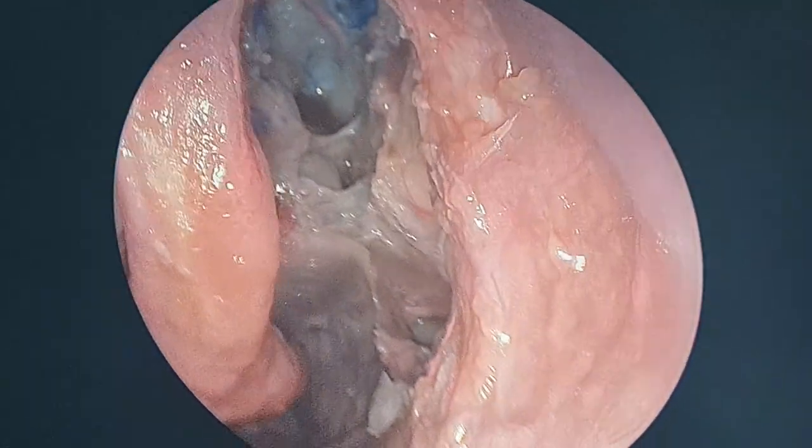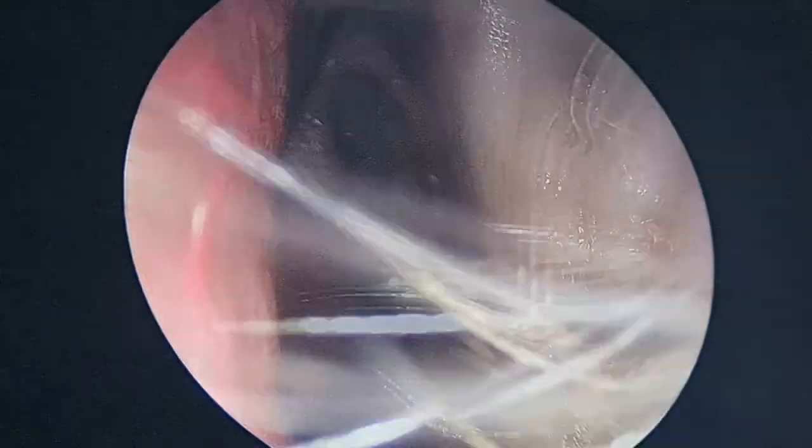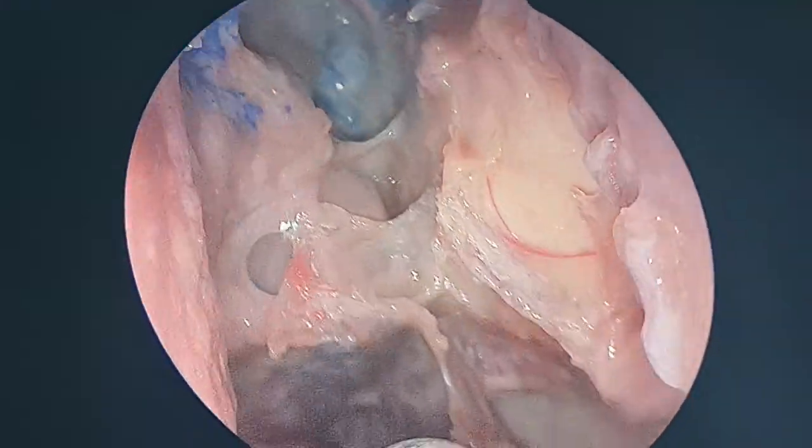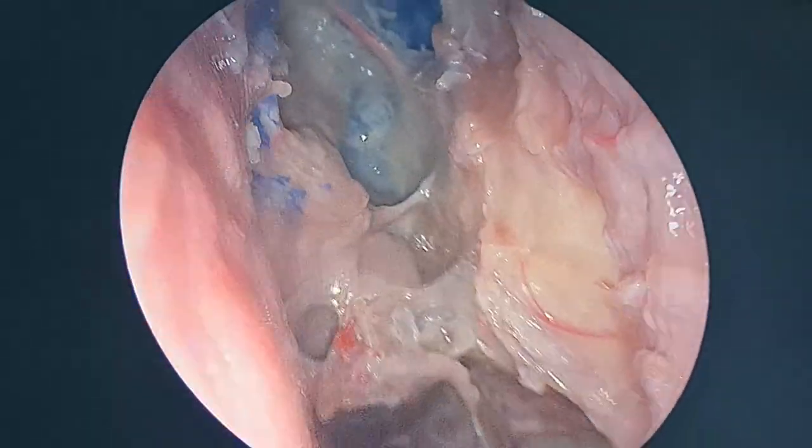I mentioned behind the posterior ethmoids is going to be the sphenoid. And in the sphenoid there are tigers hidden in the lateral wall: the carotid artery, the optic nerve. So in order to protect them, when you go from the ethmoids to the sphenoid, stay medial. And the safest way, even if you assume every case has an Onodi cell, the safest way to protect is, let me show you.